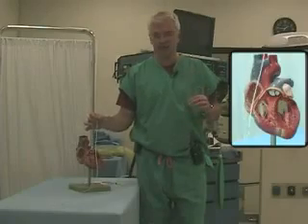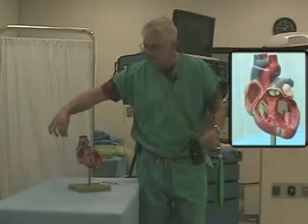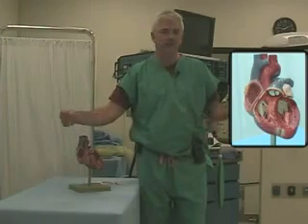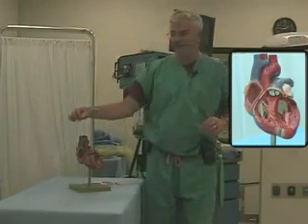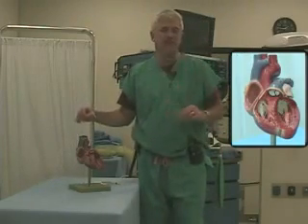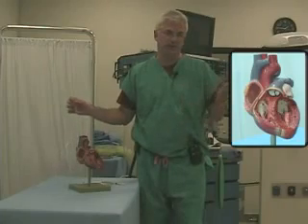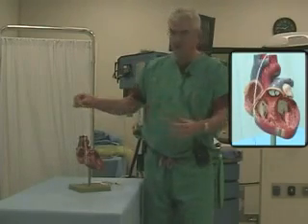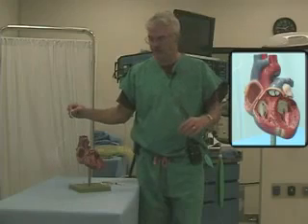What I'm going to talk about today is the actual sequence of events and where things go when you put a pulmonary artery catheter in — a few missteps that might occur along the way. Here's a way to visualize it without cutting open your patient and actually taking a look.